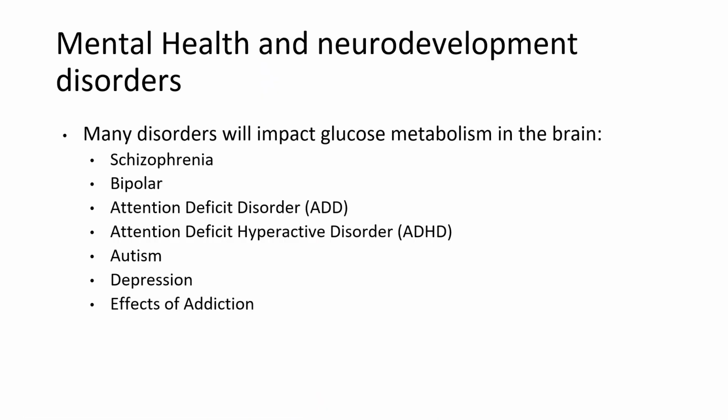So moving on from oncology, I want to talk to you guys a little bit about the use of FDG with mental health and neurodevelopment disorders. This is something that has been around for research purposes for a long time. It's not necessarily on label. So most of it is like self-pay, maybe insurances might cover some cases, but mostly it's not. And so it's mostly used in research settings.